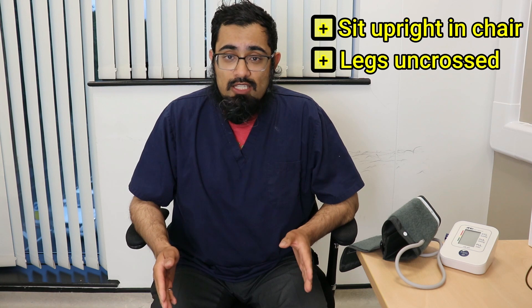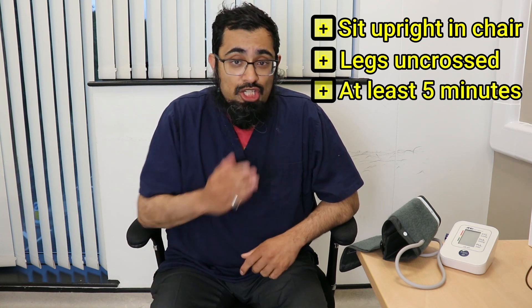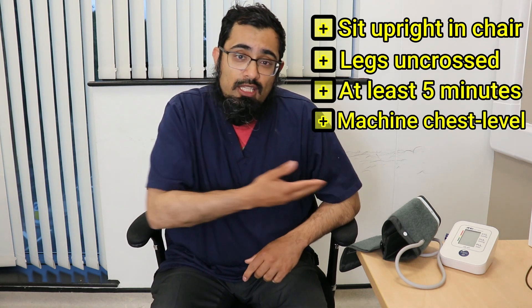Ideally you need to be sitting in a chair upright with your legs uncrossed for at least five minutes before you check your blood pressure. Make sure the machine is placed approximately at chest height.